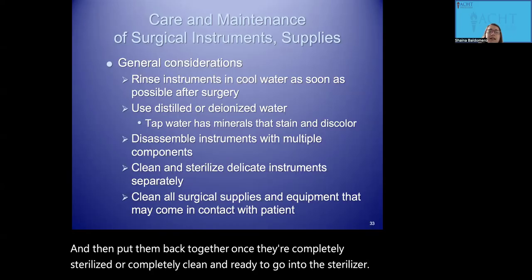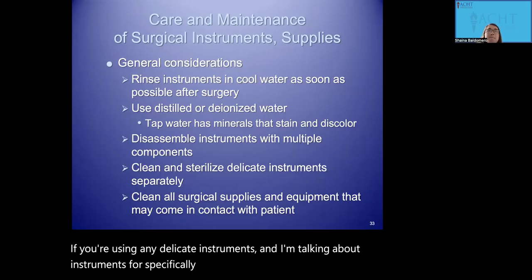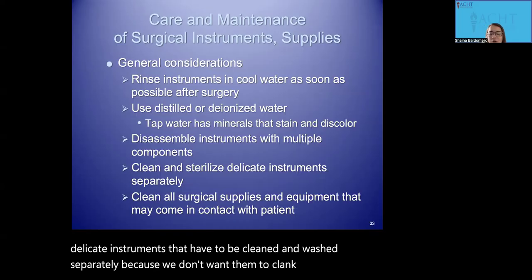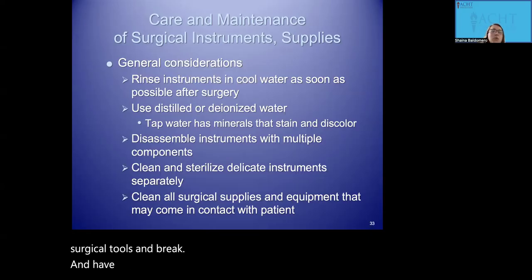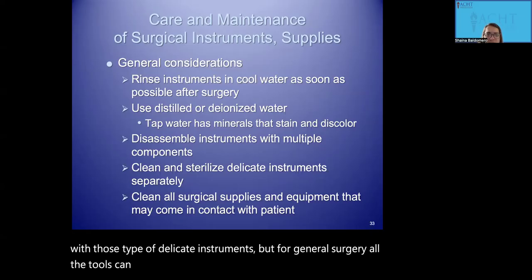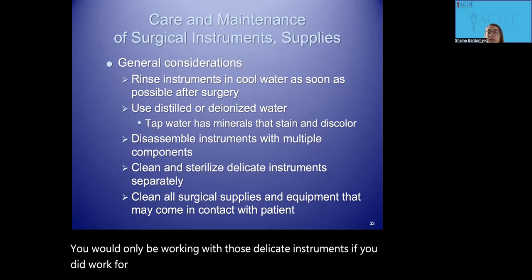If you're using any delicate instruments, and I'm talking specifically about instruments for eye surgery, those are very small, delicate instruments that have to be cleaned and washed separately, because we don't want them to clank into other surgical tools and break. So we will do those separately if you're working with those types of delicate instruments. But for general surgery, all the tools can go together. You would only be working with those delicate instruments if you did work for a surgeon, a specialist in surgery.